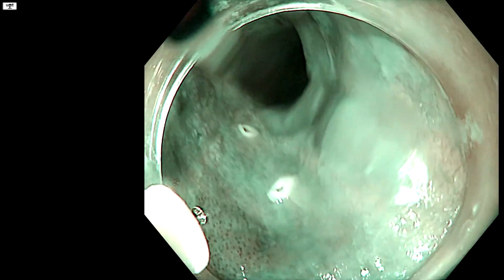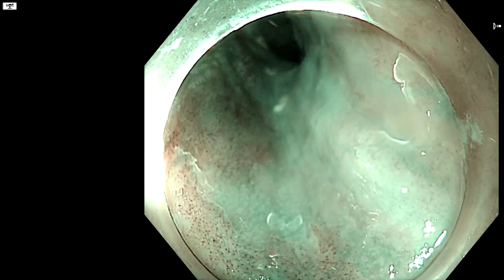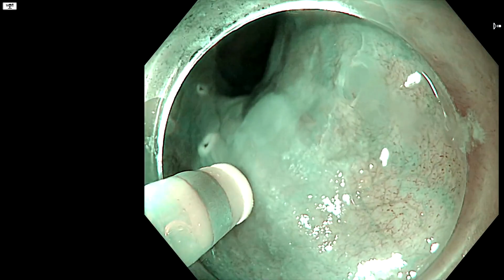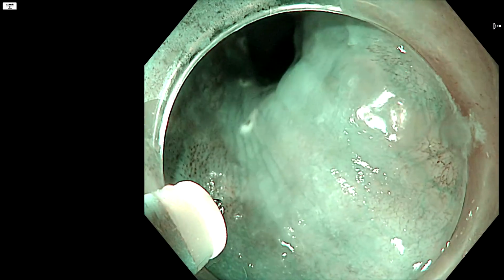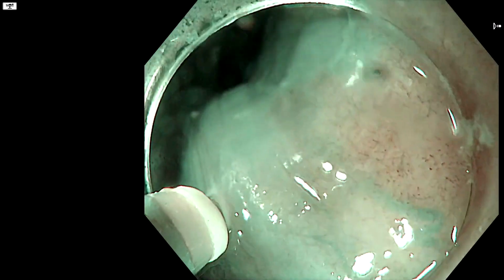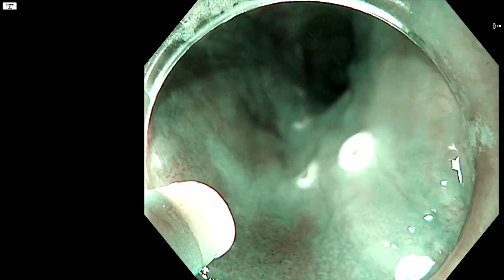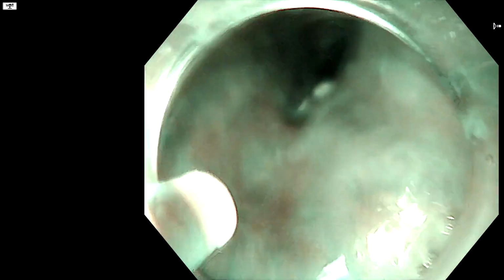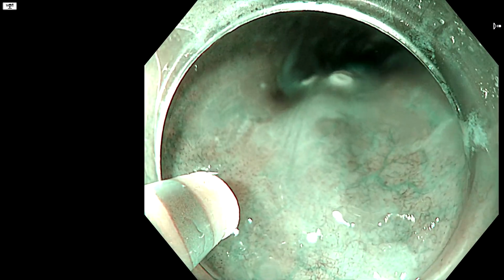I'm going to come in closer, use near focus to look at this margin. I think I can see it here. So, all right, I'm going to come off it here, open. One consideration always is the degree of the circumference that you're planning to take. Just got to come around it here though. You see again the thing coming into the view here at the 6 o'clock for me. Still at the 6 o'clock. Maybe the edge is very difficult to see here.